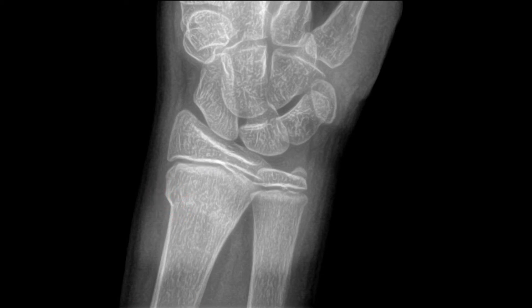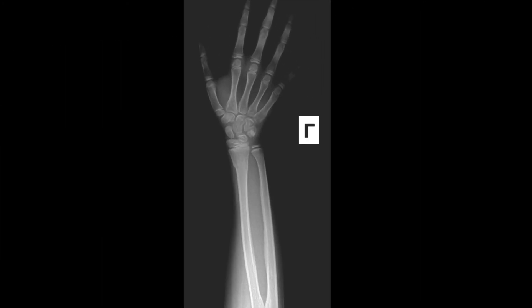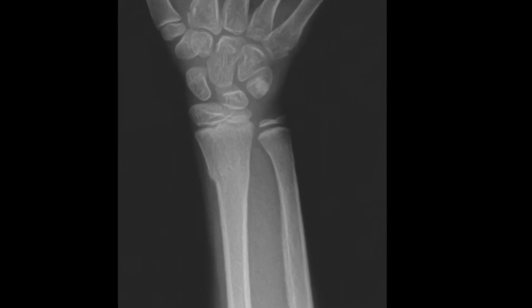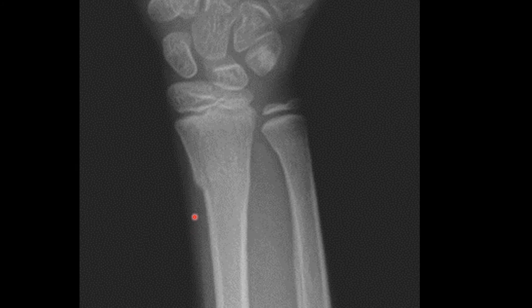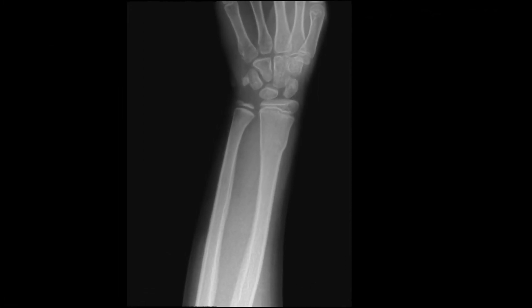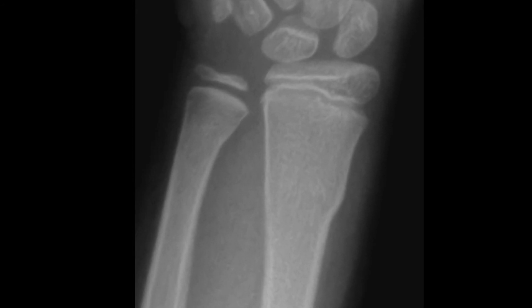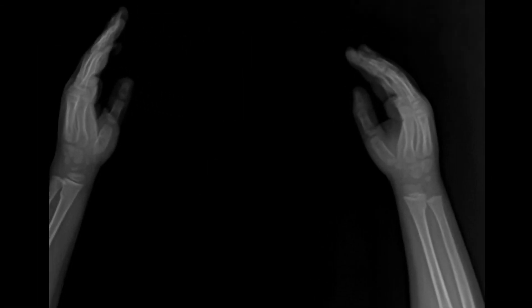Here's a good example of a torus or buckling fracture — another patient with a FOOSH injury. Not a great quality image, but if we zoom in, you'll notice a torus or buckling fracture at the distal radial metaphysis. This is a ten-year-old male who fell off a skateboard, and you'll notice at the lateral aspect of the distal radial metaphysis the torus or buckling fracture — very easy to overlook, and if you don't specifically look for it, it's very easy to miss.